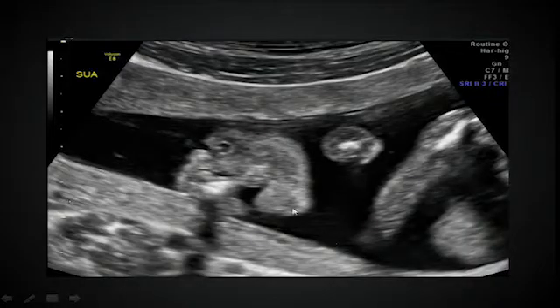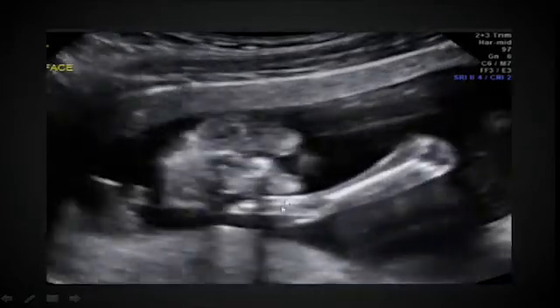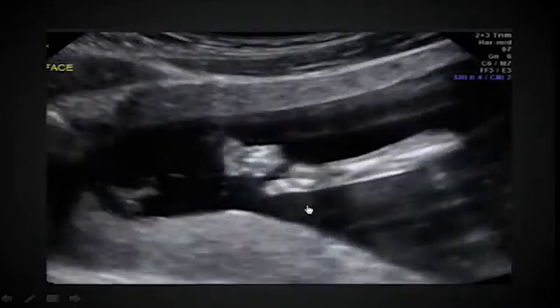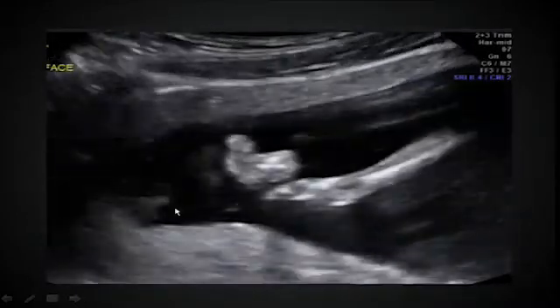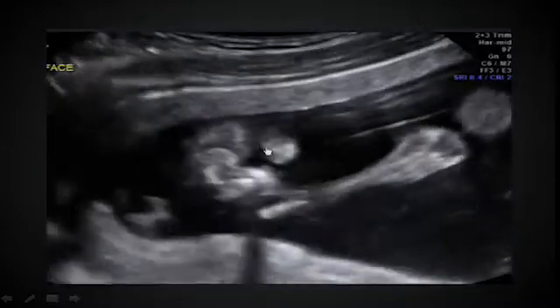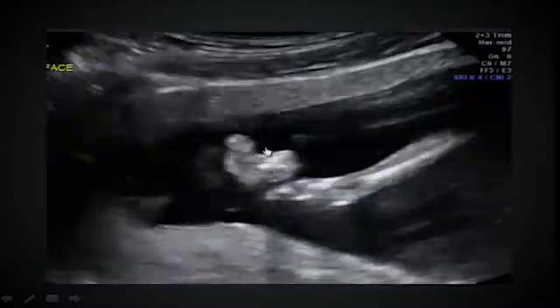It's looking across the front of the face. This is looking at the chin, the cheeks. Here's an orbit with the lens of the eye. Look here, there's this big cleft here, following it all the way up through the orbit. And then we see this little attachment. And again in real time, so looking at the front of the face. Hand again. So you can see how that comes in. There's a distortion from the maxilla up through the orbit, through the middle of the head, and then over towards the side.